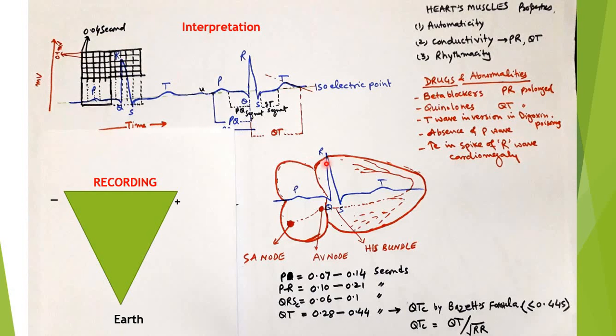In certain abnormalities like cardiomegaly, when the ventricle muscle fibers are thickened and the size is increased, generating an action potential here produces very high R wave spikes. A high R wave spike suggests possible cardiomegaly, which is confirmed through chest radiograph and echocardiography techniques.